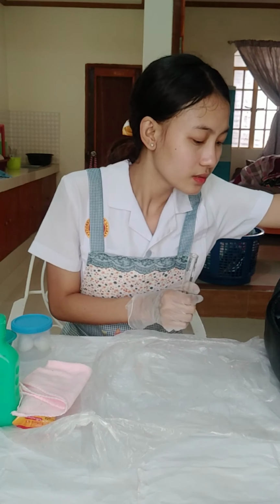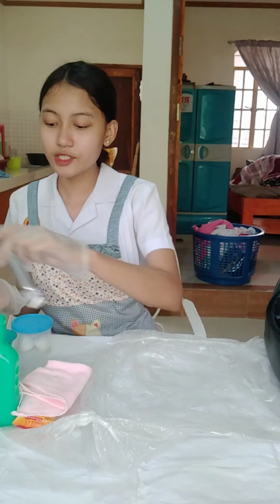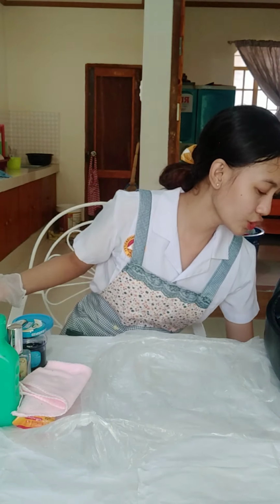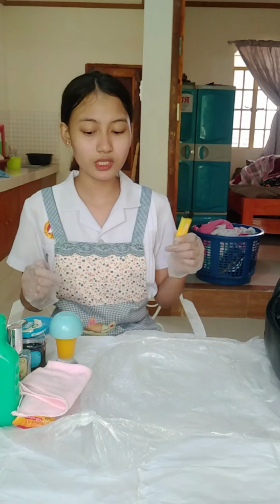Then after that, take out the droppers and put them on the kidney basin, and also the test tube clamp. And then the 10% acetic acid and the Benedict solution. Make sure that the urine specimen is separated in the CHN bag. I have here, assuming that this is a match, and the alcohol lamp, so assuming that this is the alcohol lamp. And then I have here the waste receptacle.